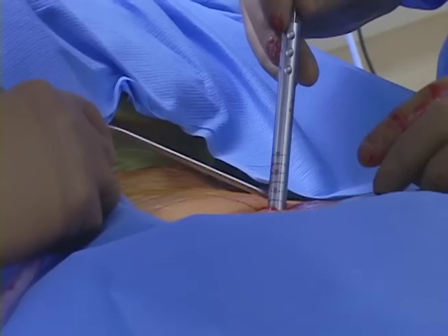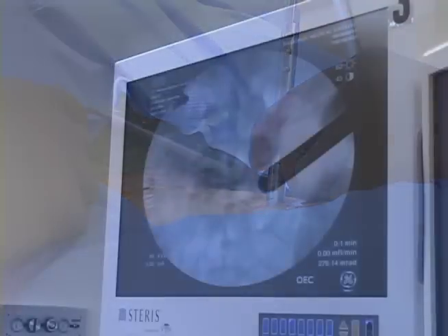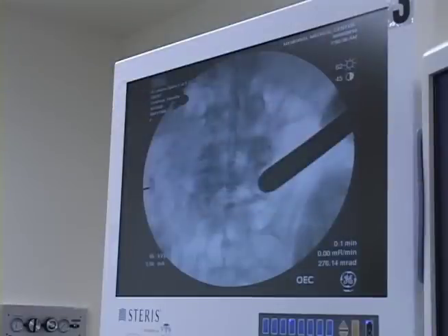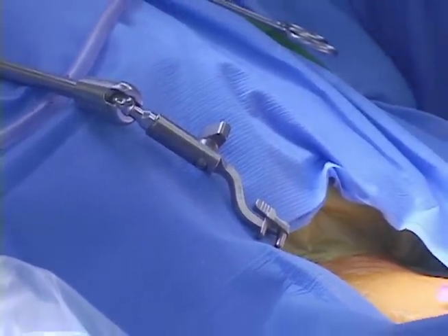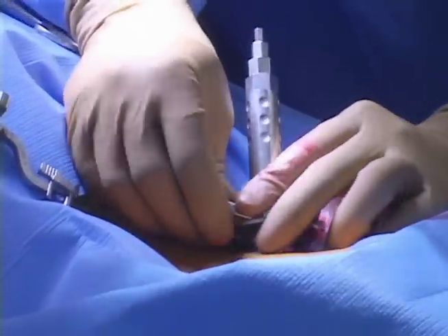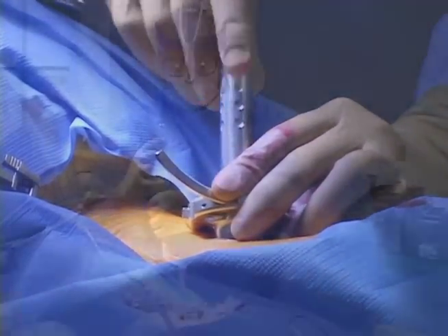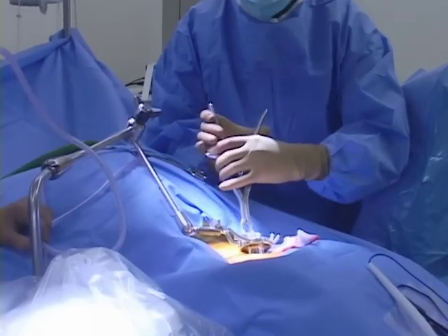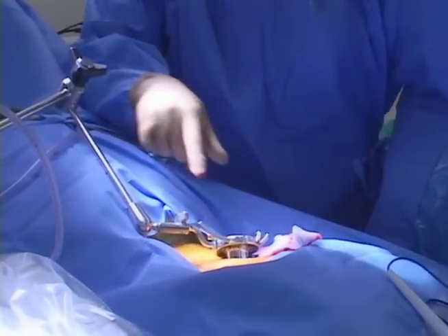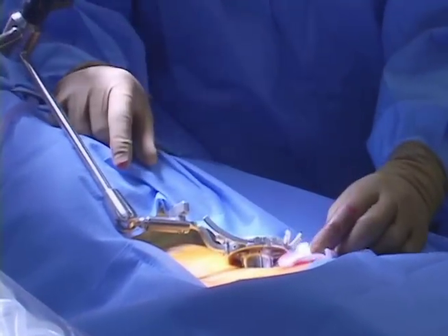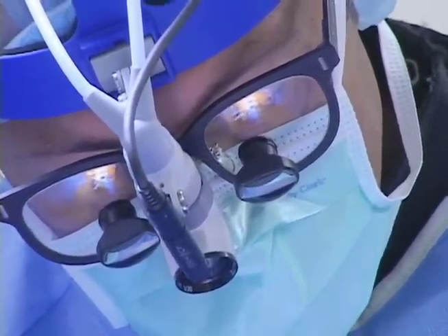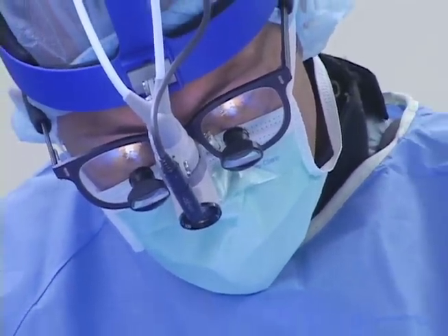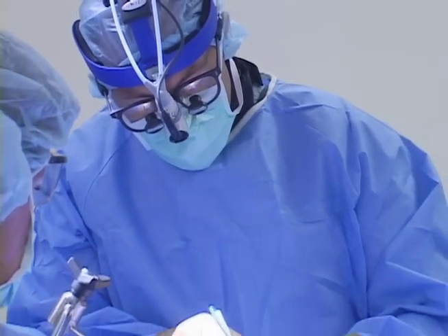A lot of this is done with x-ray — fluoroscopy is a really important part of the procedure. Now we have a picture in both planes of our dilators coming down. I've got the dilators going in and we're going to set our retractor blade in, secured to the table. I can expand open the retractor blades — it's about as big around as my index finger, and this is the working channel for the rest of the case. I'll take down some of the muscle off the bone, though most of the muscle has been split, so we're going through the muscle atraumatically.